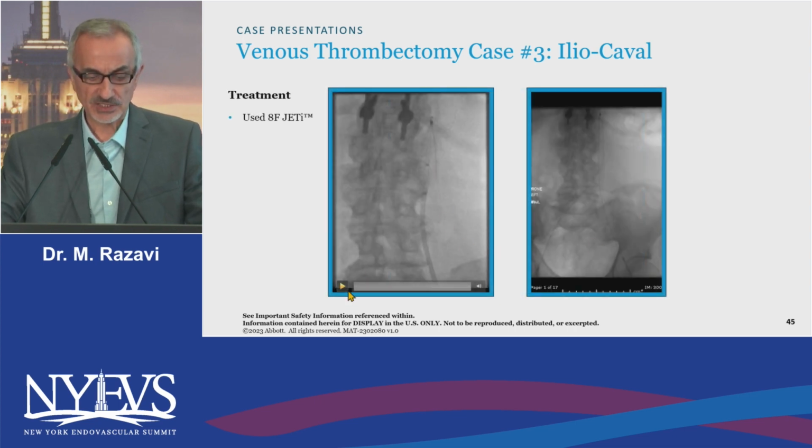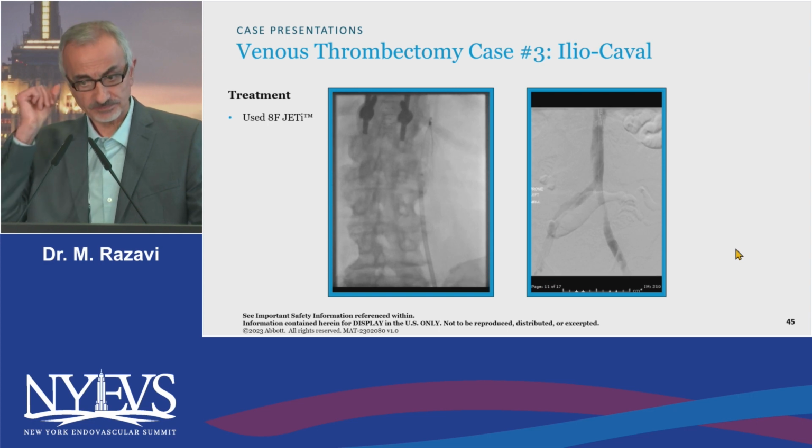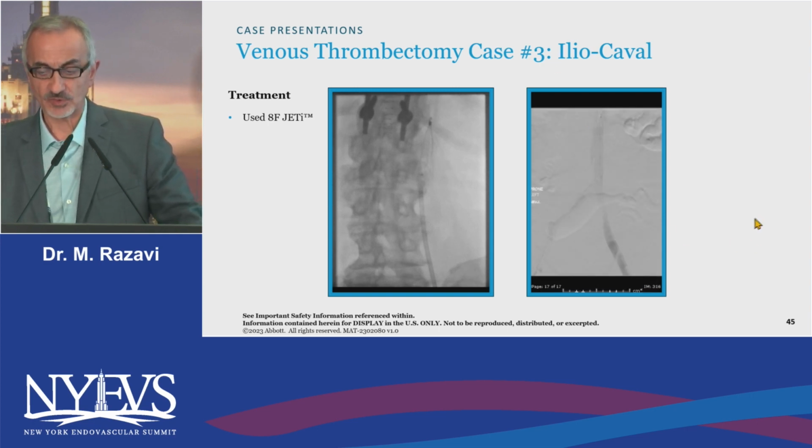And this is our technique in the filter. You can go from side to side, and you're using a curved catheter to go from wall to wall and clean everything out. And here's on-the-table flow. Little bit of residual clot in the filter, but on-the-table flow. So even in the setting of phlegmasia, we can do these very rapidly.